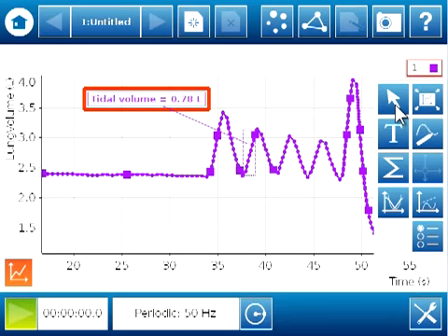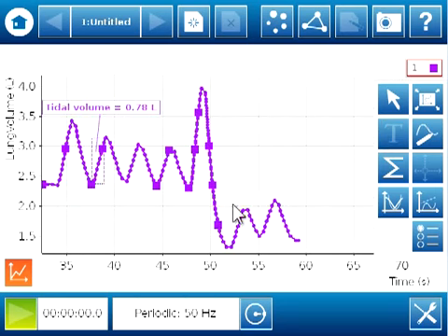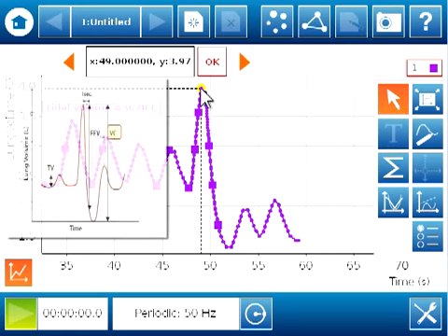For this measurement, we'll analyze data that corresponds to the person exhaling as much air as possible out of their lungs. I'm going to move my graph over a little more. So in the center of the graph, you'll now see that maximum breathing effort from the data I collected in part 1. So I took a deep breath and then forcefully exhaled as much air as I could out of my lungs. I'm going to use the Select tool again to highlight the region of interest.